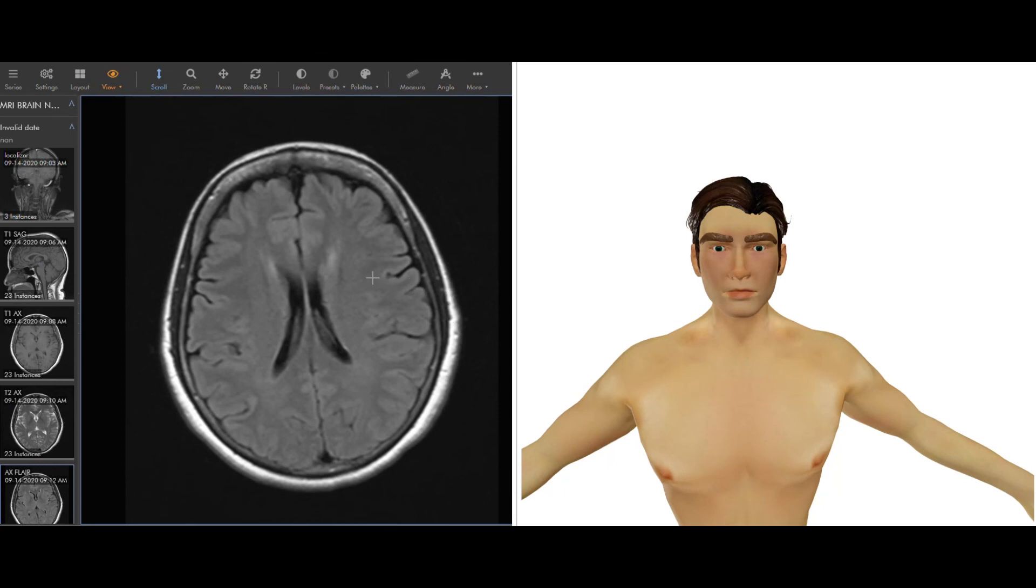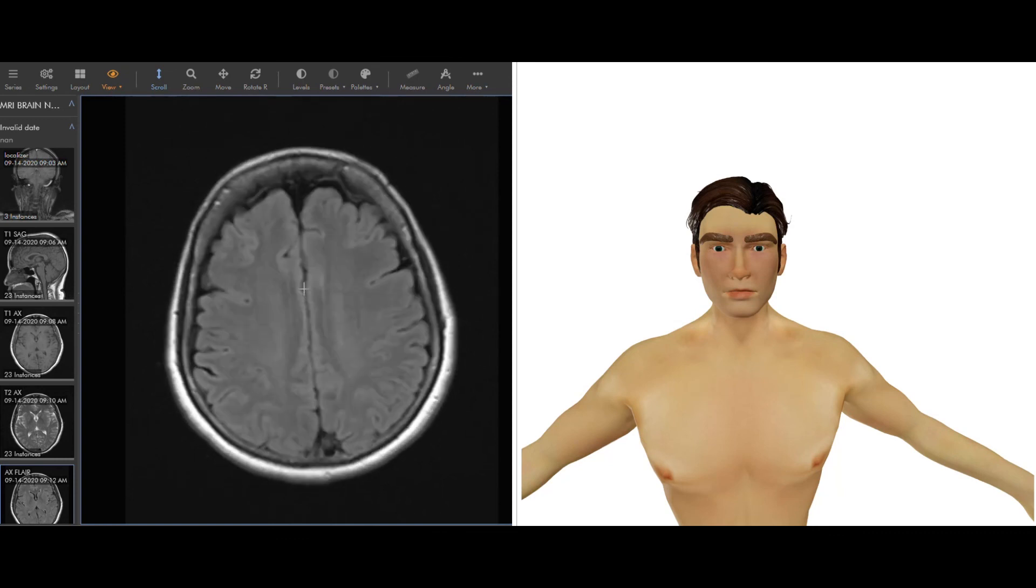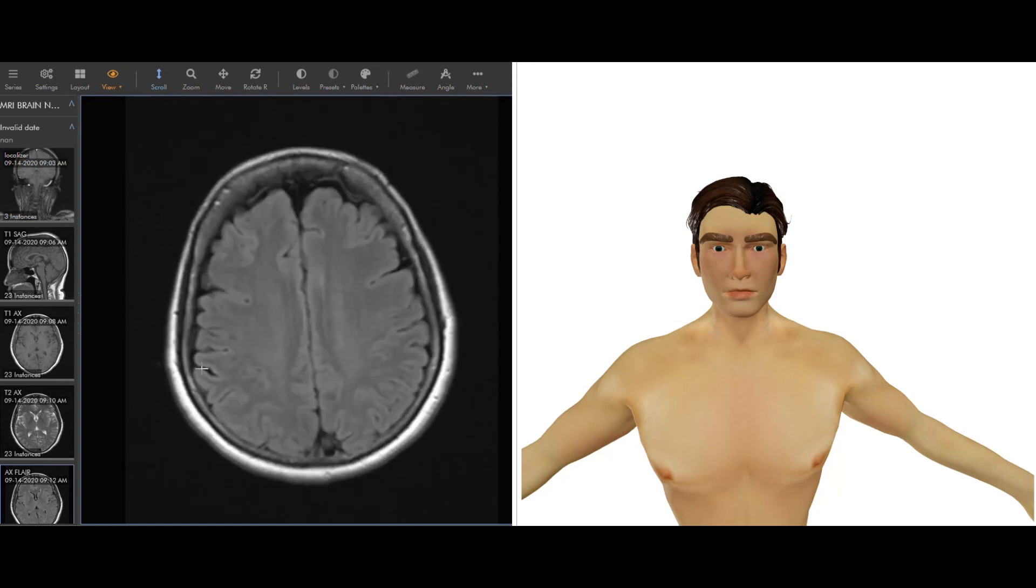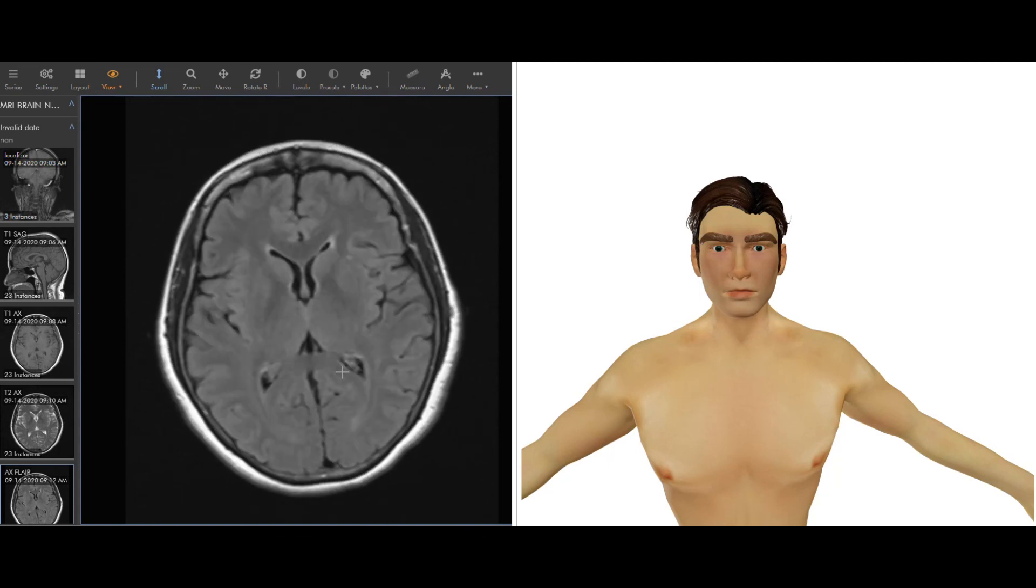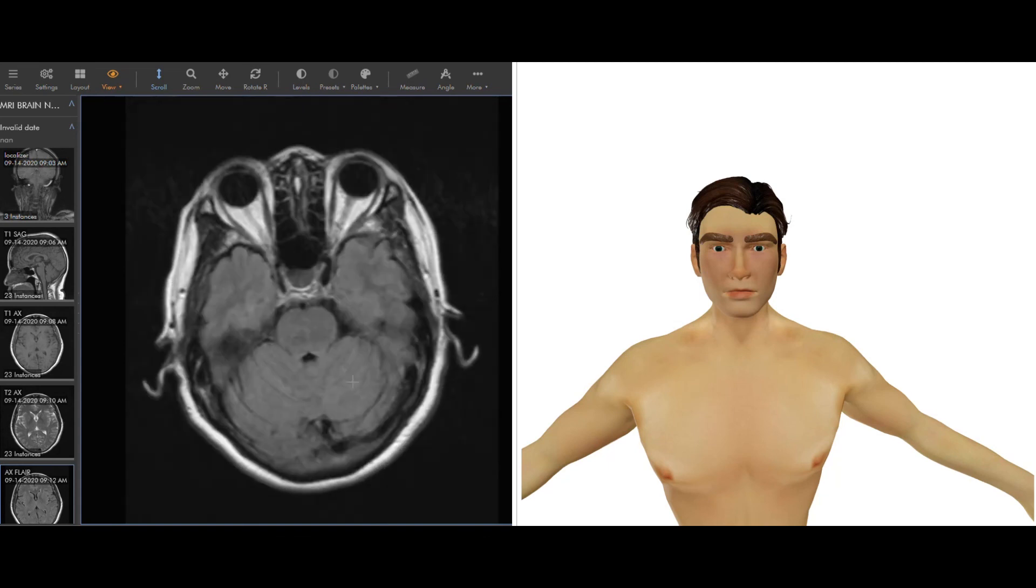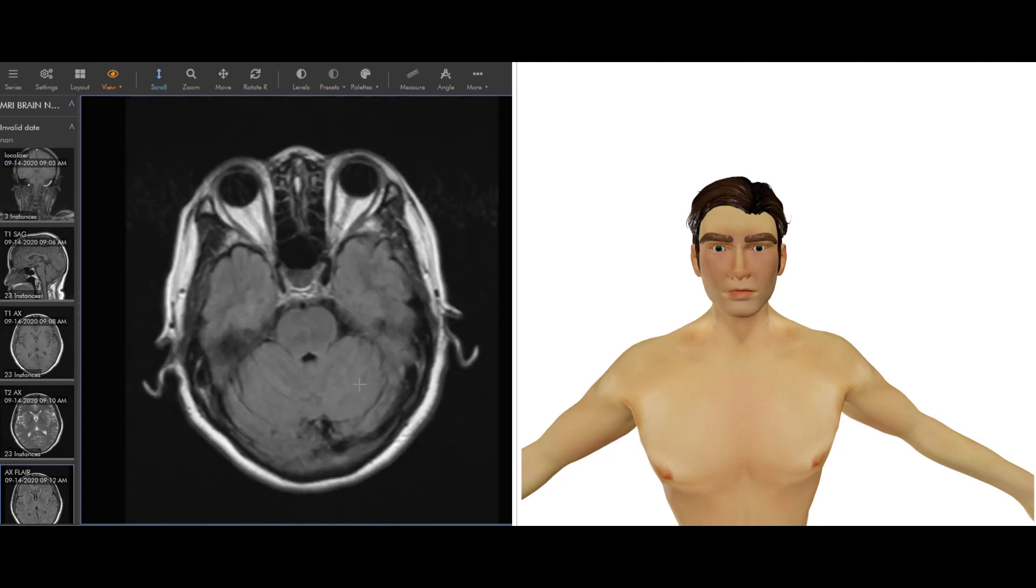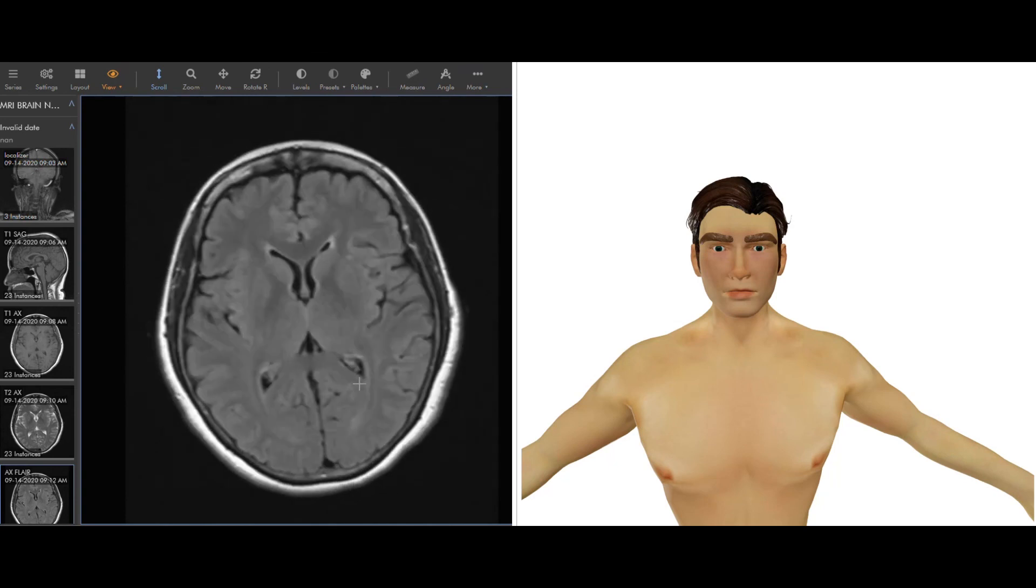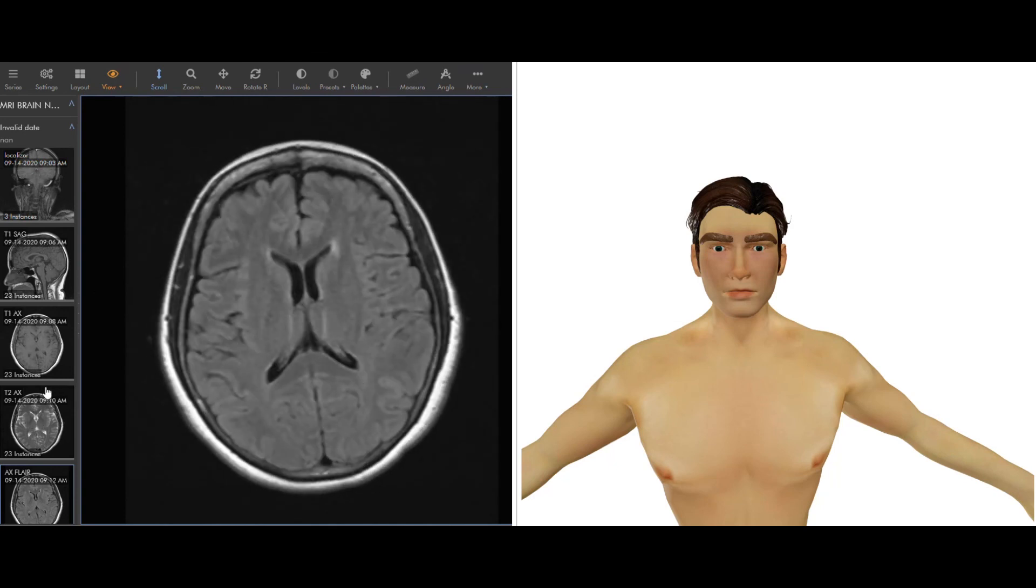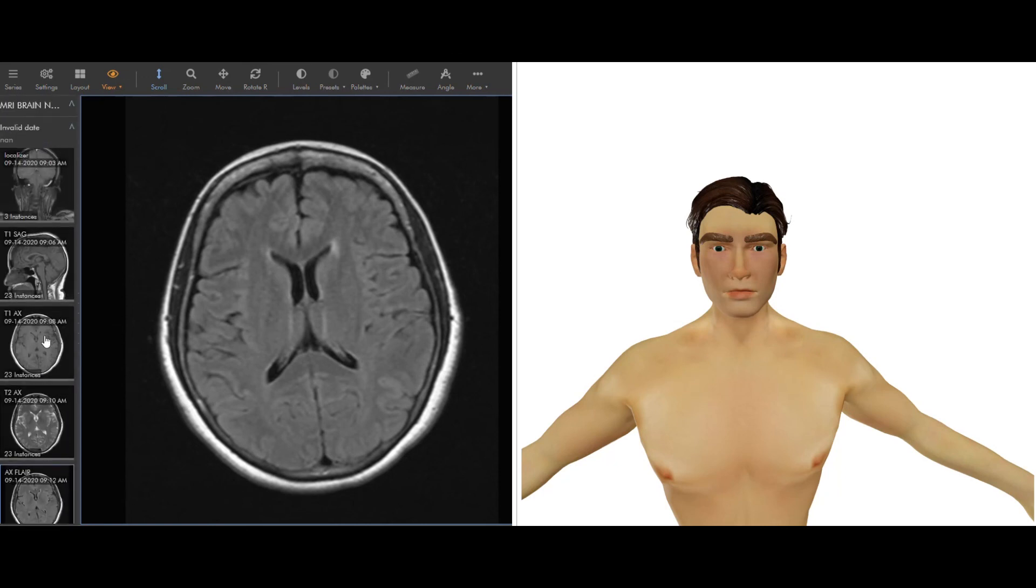Those are the basic brain sequences and spine sequences. I went through those in particular because they pretty much will encompass most of what you'll see in the rest of the body as well. So the key takeaways are that each of these images are a slice. You can scroll through them, and that will encompass a stack of images or a sequence. These names here, these are sequences, and each sequence is sort of optimized to show different things to us as radiologists.